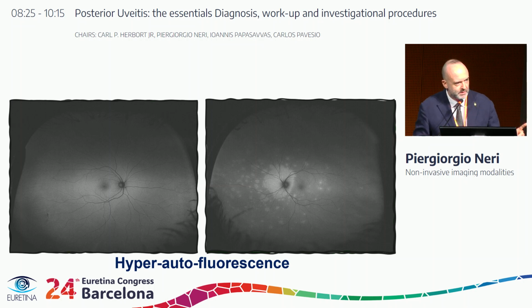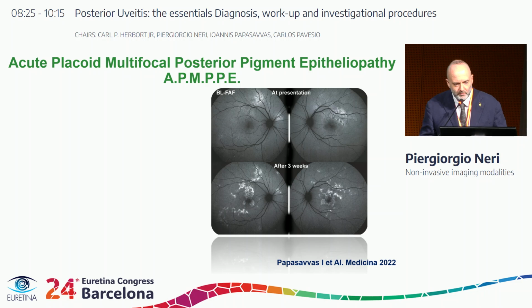One thing that is important is that this is possible only if you run the autofluorescence before you take multiple different pictures, because otherwise you can have the effect of the glare, which can mask the potential outcome of your test. So now, it is important also to see that this can be applied in multiple different diseases.